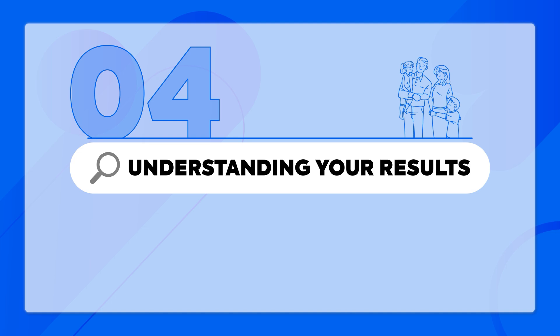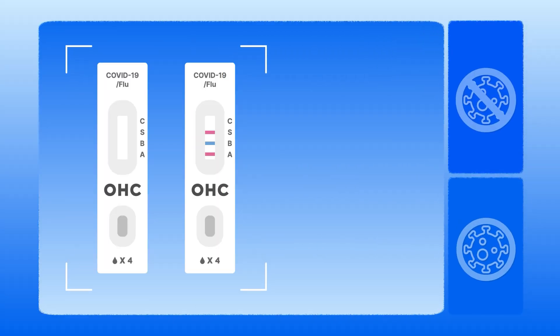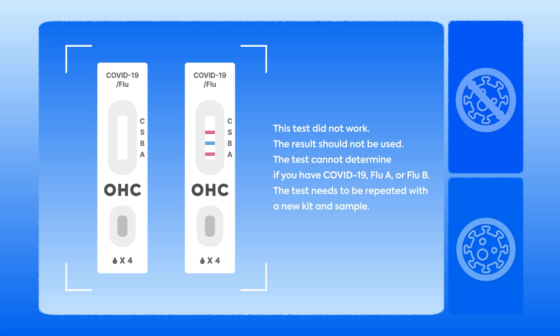Understanding your results. For invalid results, this test did not produce valid results and should not be used. It cannot determine whether you have COVID-19, Flu A, or Flu B. Please repeat the test using a new kit and sample. This test did not work. The result should not be used. The test needs to be repeated with a new kit and sample.